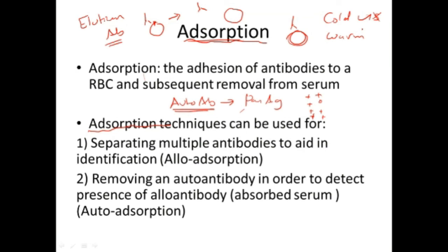يعني هي تعتبر مع الإنزيم والسلكتد سيل هذه طريقة يعني؟ إيه بس هذه شوي complicated، هي مو بسهلة يعني كثير. حتى شفت مستشفيات يقولك ما نسويها، احنا نسوي الانزيم ونسوي selected cells. أما هذه تحتاج واحد عنده خبرة، مو أي أحد يقدر يشتغل فيها. أوكي، فاحنا الحين بندرسها سوا and we will understand it إن شاء الله.